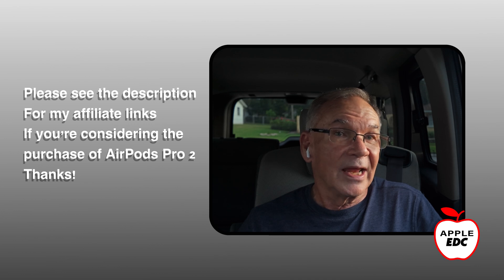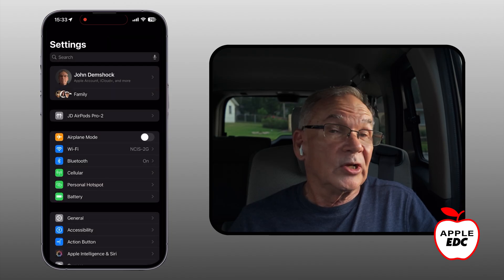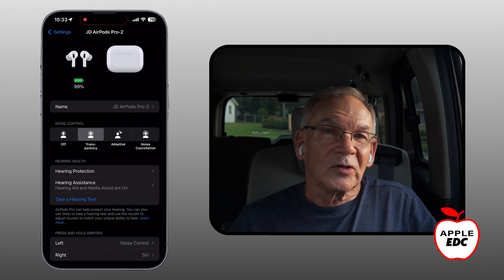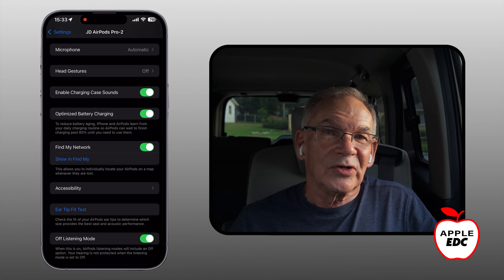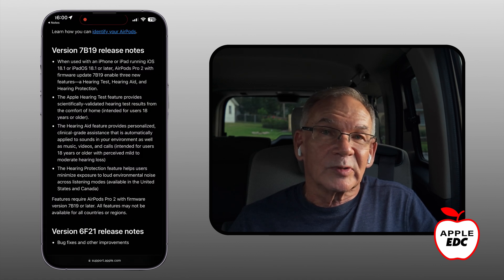If you've had them in your case and they're fully charged and they've been near your phone recently, they should have automatically updated to the latest firmware version in the background. You can check that by placing your earphones in your ear or opening the case next to your phone, then go to settings and scroll down to find your AirPods. Click the little eye circle at the right and then scroll down to see your firmware version. If you need more help with the firmware update, please check the description below — there's a link to the Apple support page for AirPods firmware.